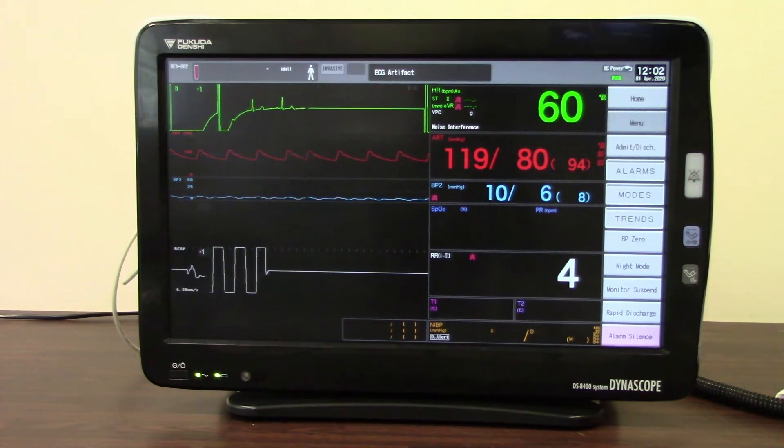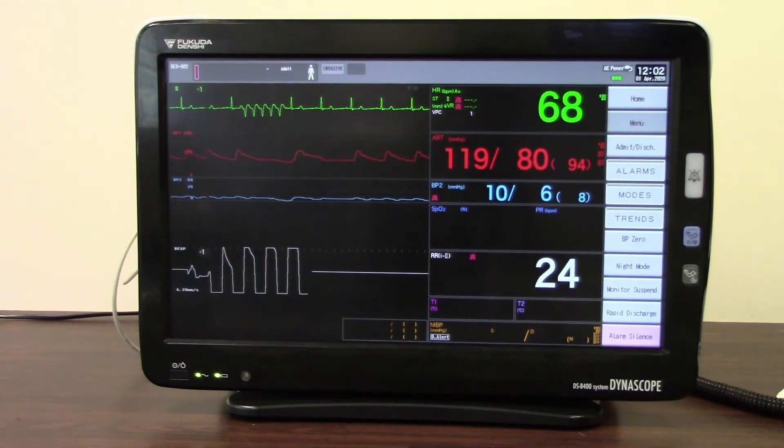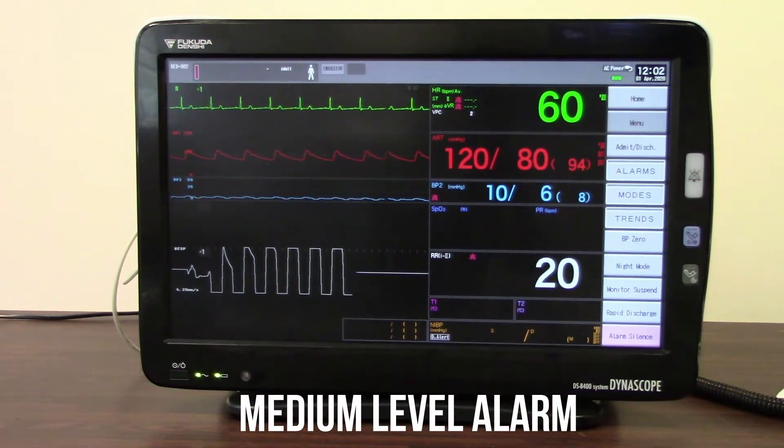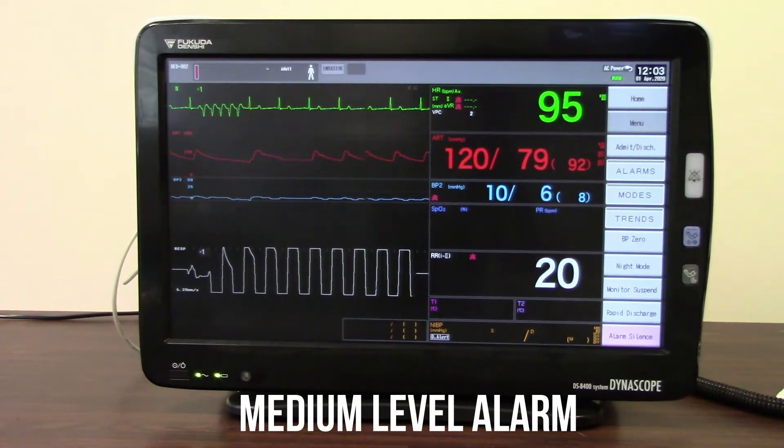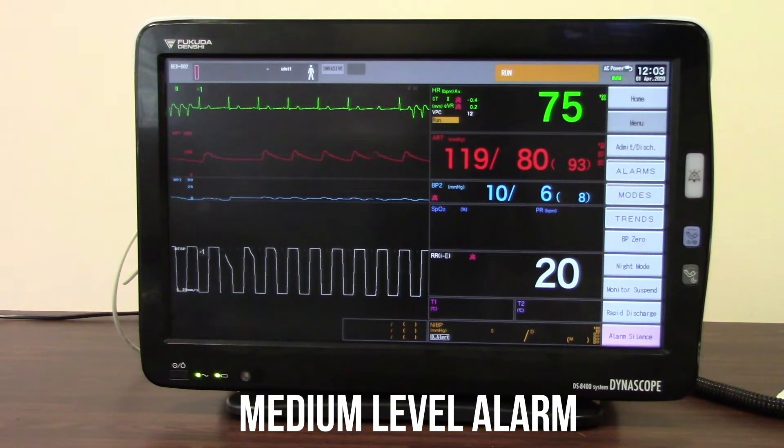The next alarm we're going to listen to is a medium sounding alarm. You'll see yellow flashing lights on the top of the monitor, and you will also hear a different type of alarm tone for the medium level alarm. So it allows you to differentiate between the different types of alarms. Here is our RUN alarm — it tells you there's a run at the top and it flashes in yellow.